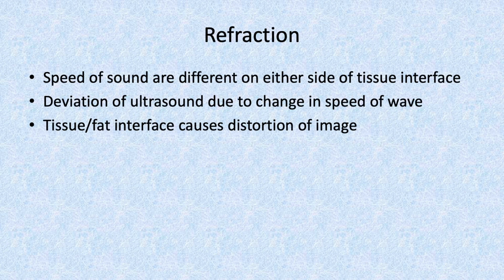Okay. Then refraction. Not all the waves are reflected back into the probe. Some are just refracted. Refraction means it goes sideways. So this will affect the image. It will not be a sharp image. It will become a bit blurry on the screen.